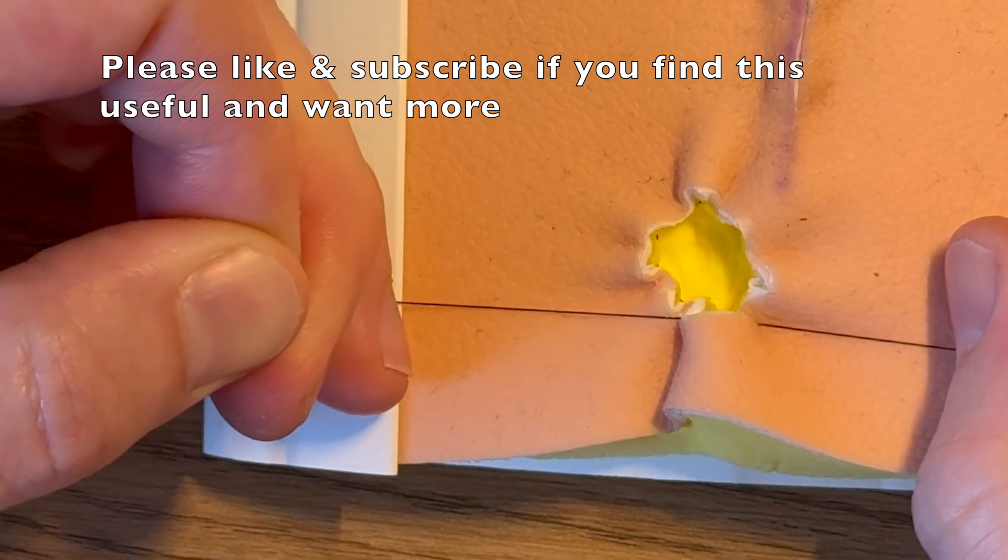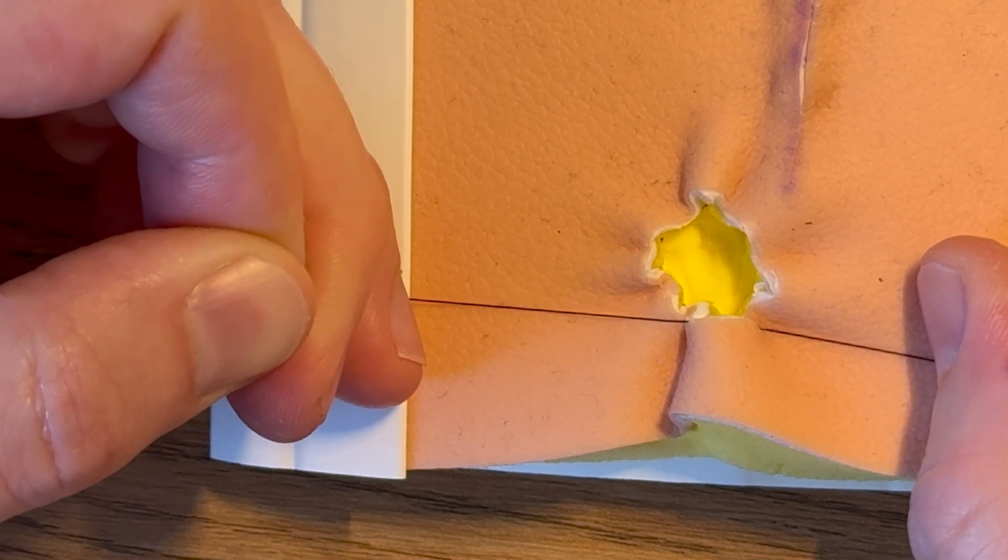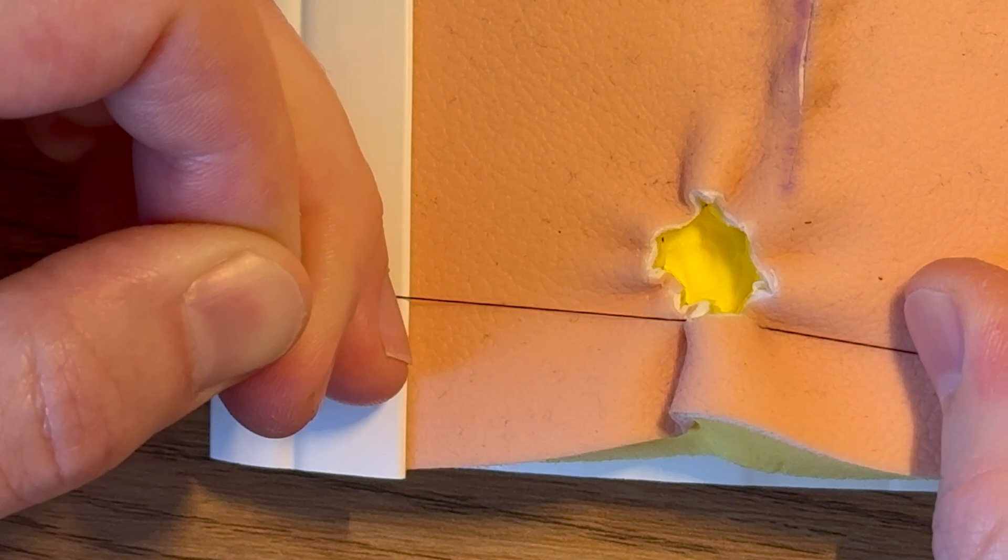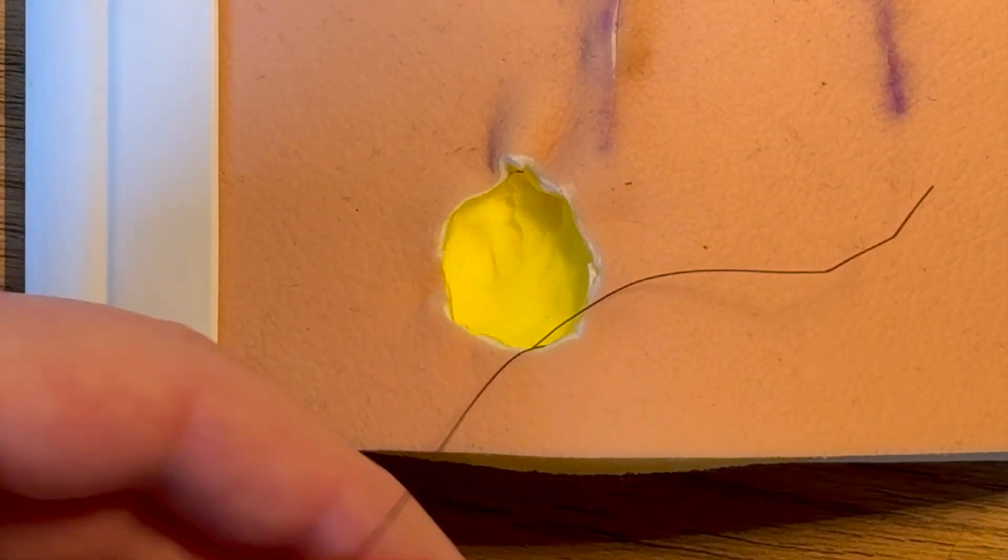So don't push it too far. Get it to 75 percent, 50 percent, something like that. That's going to be about where you can get it to for most of the wounds this sort of size on a scalp. If you pull it further it will snap. So then we've got the two ends like this.